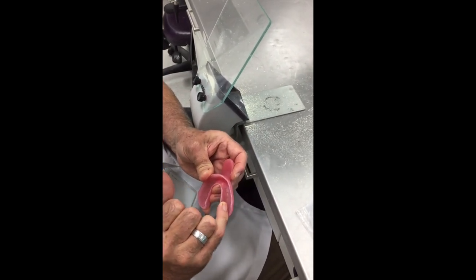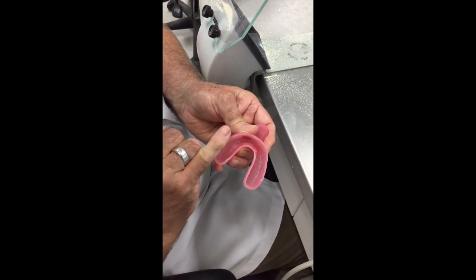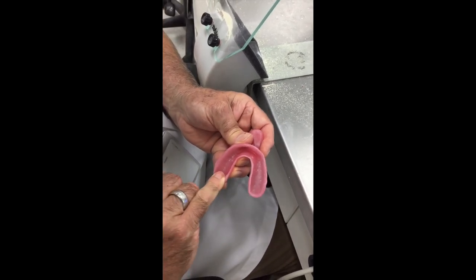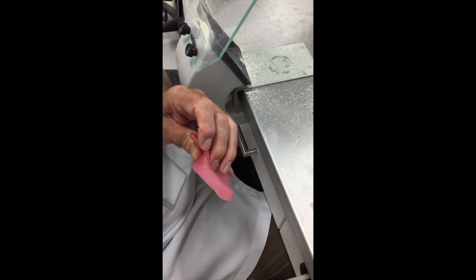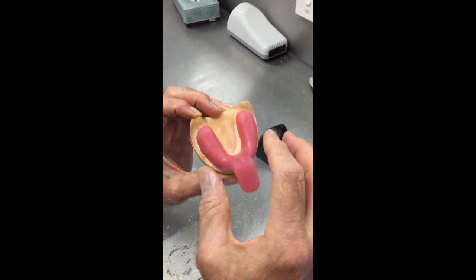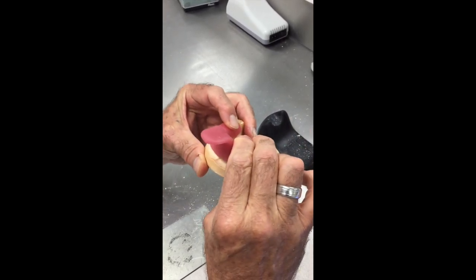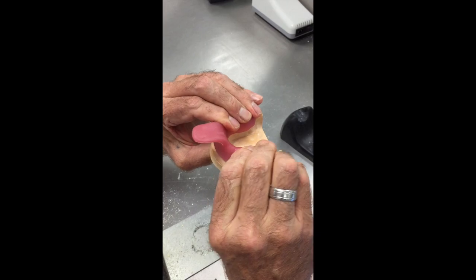I'm just checking that. I like to check that with my little finger, because that will show up any areas that are a little bit sharp. My little finger is infinitely more sensitive than all my other fingers, because it's hardly ever used. Now we're going to place that back on here just to make sure that it's going down to that line all the way around. And you can see that when we place this in on here, we get a nice positive setting of that onto those tissue stops.